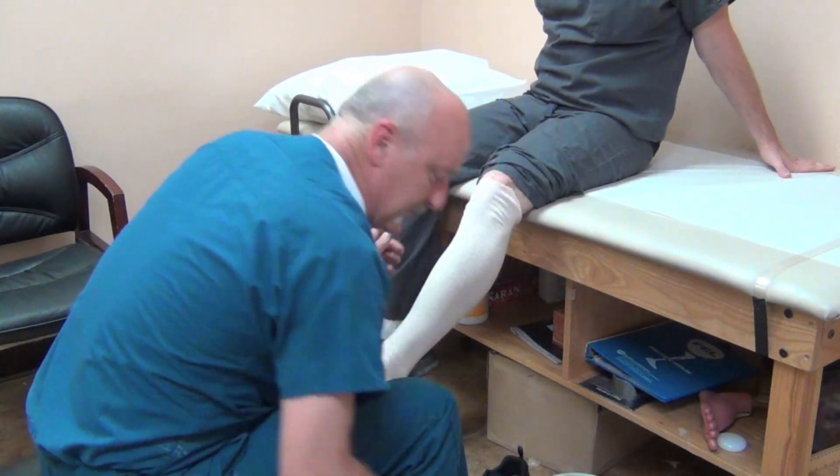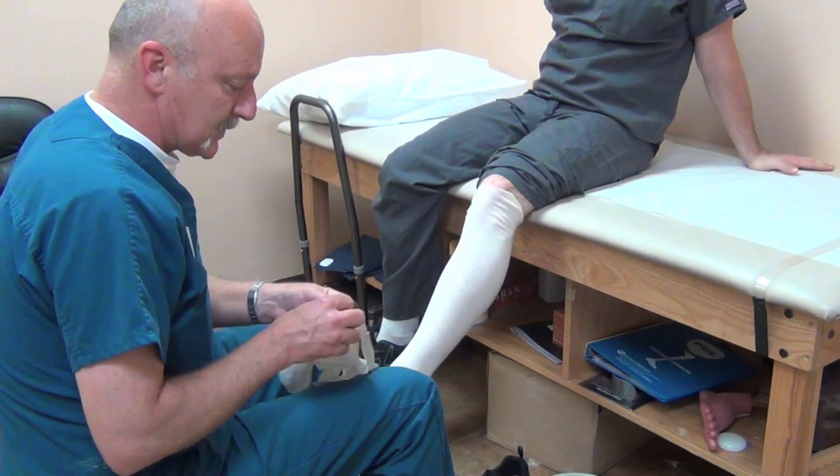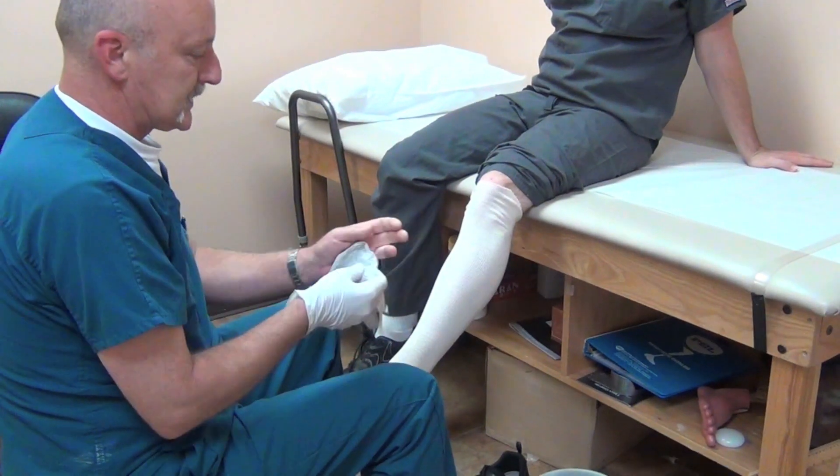I use synthetic material for casting, so I always wear gloves — it's really sticky stuff.